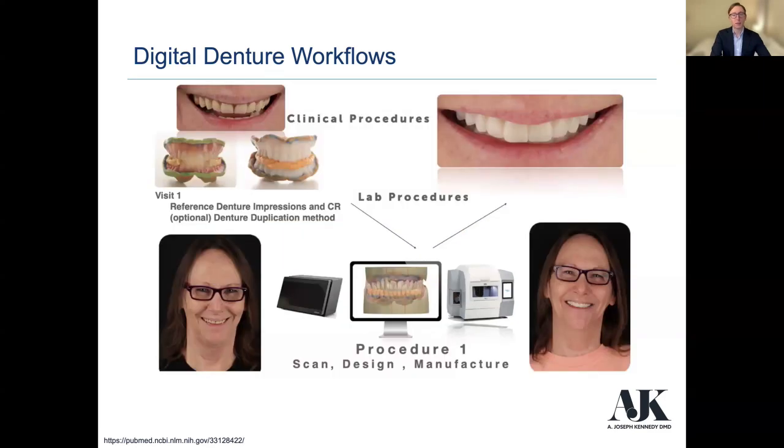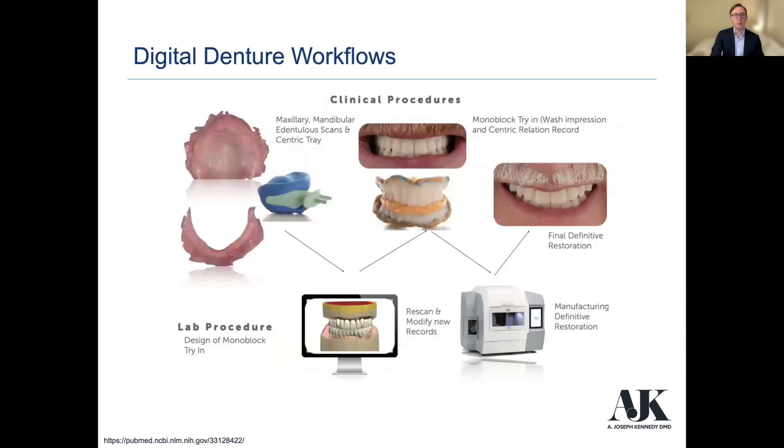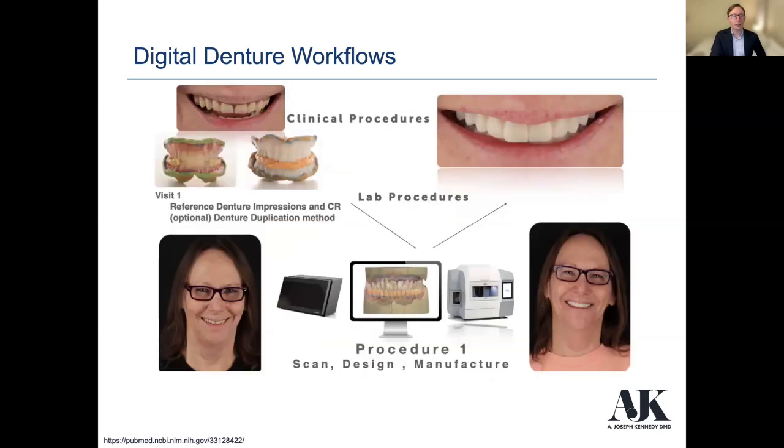Now, the really neat thing is that if the patient comes in already with a denture, well, you can go ahead and take their existing denture, assuming that they're relatively happy with it. And then you're already kind of at step 2 here, right? You've got the try-in here. So you can use that as a custom tray for a functional impression there.